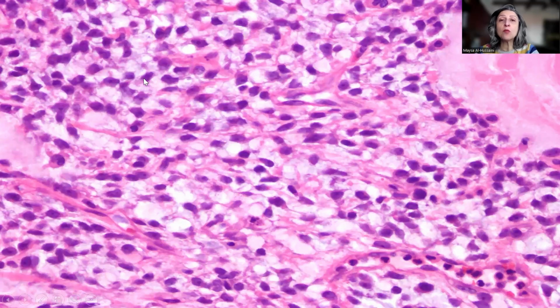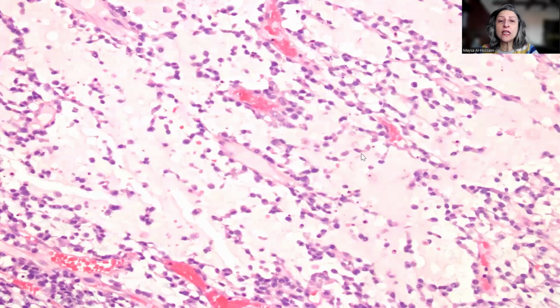And then again, moving more towards the myxoid areas, because part of the tumor was extensively myxoid. You can see here that the cells are actually pink in color. Why? Because of luteinization of the cytoplasm. And then coming here into the area which was extremely myxoid, some of the tumor cells even were adherent to vessels, giving an impression of pseudopapillae formation.